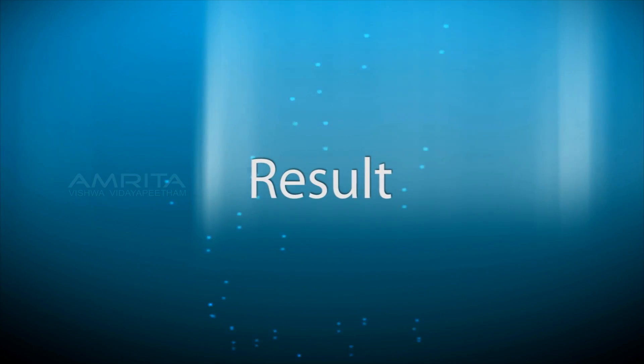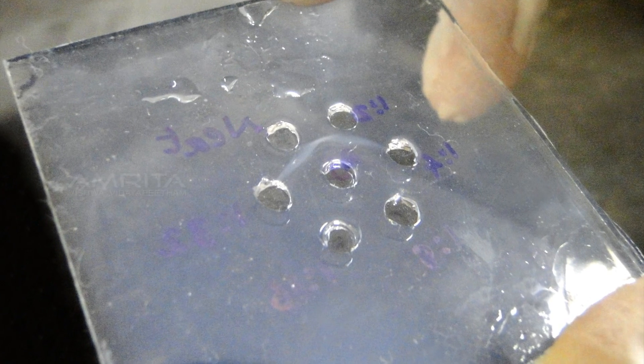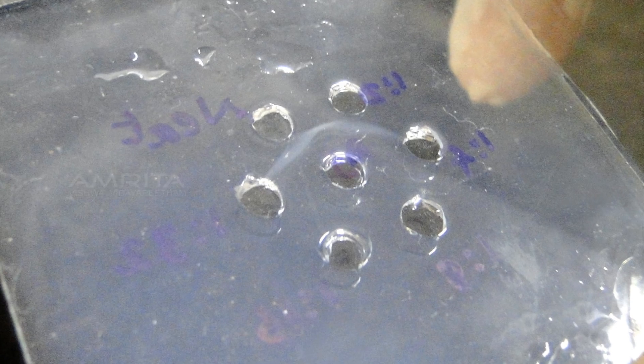Result: The highest dilution at which the precipitant line formed is 1:2. This is the titer value of the antiserum.